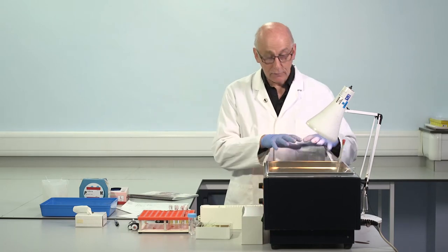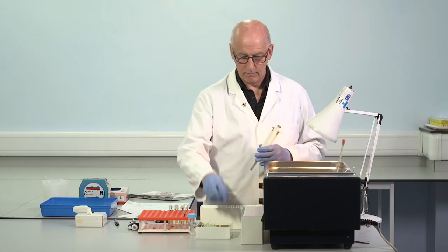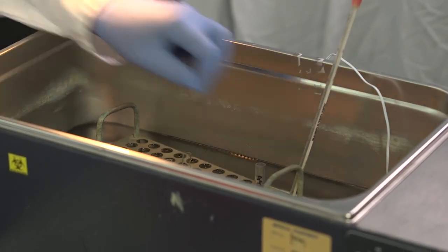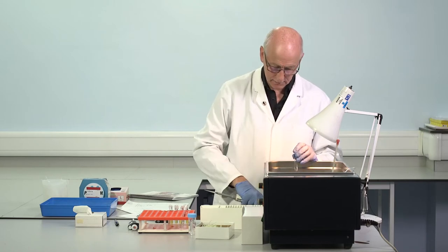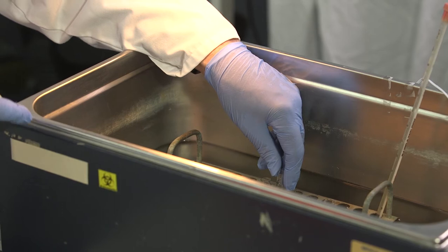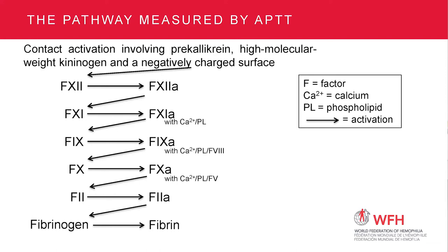From earlier. So we've got the plasma present in the tubes. Simply coming up to temperature, coming up to the 37 degrees. Okay. So we're going to add APTT reagent to the first one and mix. Start the clock. And then at 15 seconds, APTT reagent to the second of the two duplicates. And mix. Activation, 12 to 12A, 11 to 11A. No further at the moment until we add the calcium.